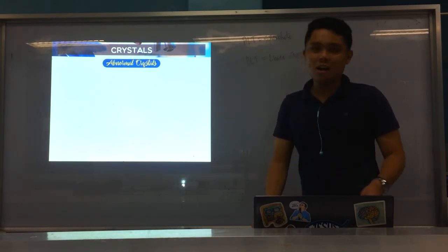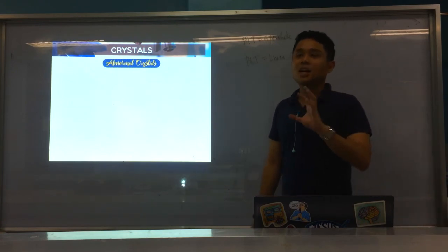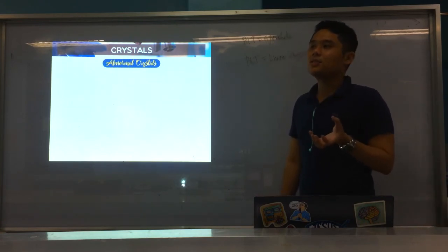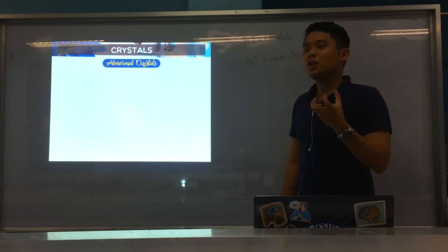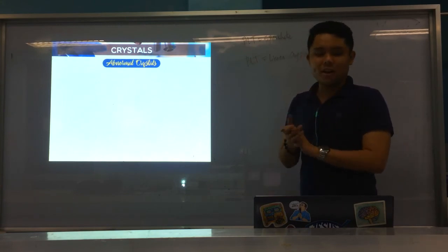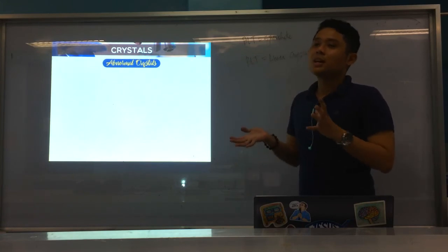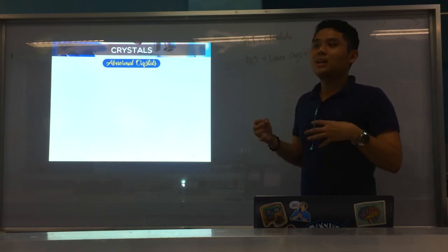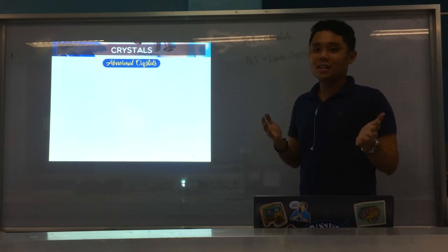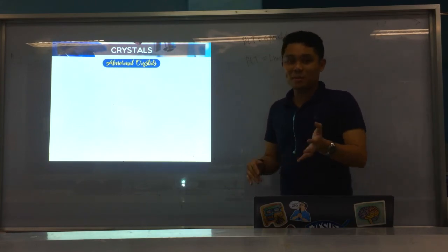Alright, okay. So, why are tyrosine and leucine usually seen in liver disease? Because again, these are amino acids. Alright? And amino acids, usually, they're all synthesized in the liver. You know, liver plays an important role in the synthesis of proteins and amino acids. So, if may damage ang liver, of course, dili siya ma-form. Pero, ma-leak ito yung mga na-form na amino acids into the bloodstream. Okay? Resulting to the formation of the crystals. Okay? If I'm not mistaken.